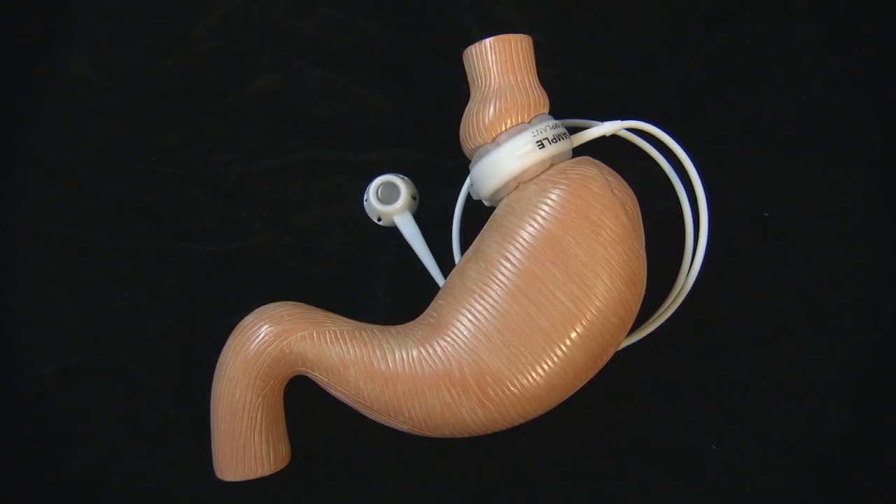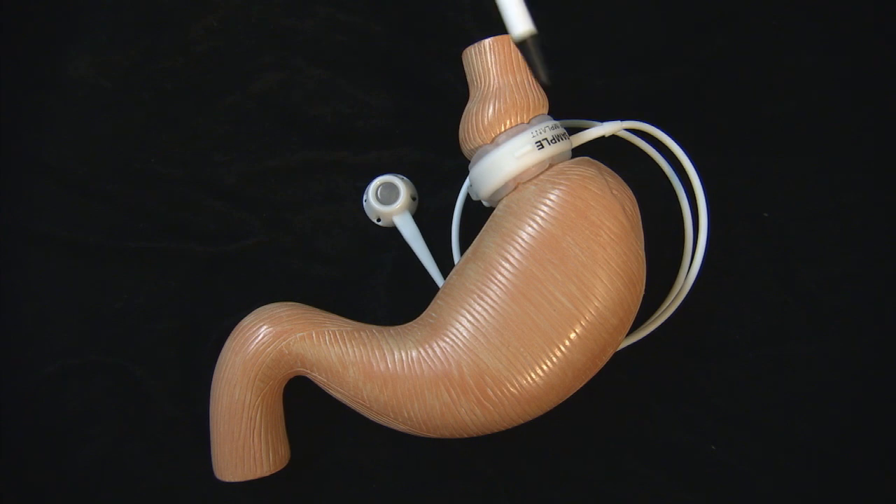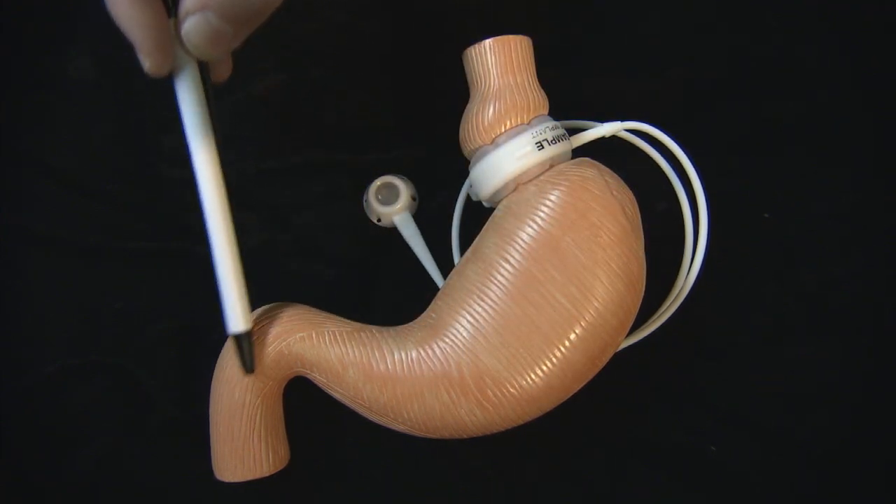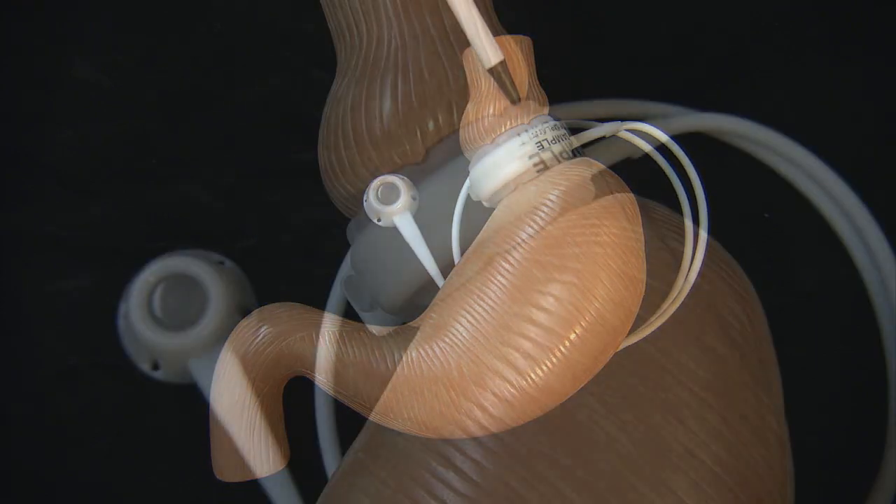This is a brief demonstration of how an adjustable gastric band works. Seen here is a model of the stomach. This is the main portion of the stomach, this is the small intestine, and this is the entry of the stomach from the esophagus.